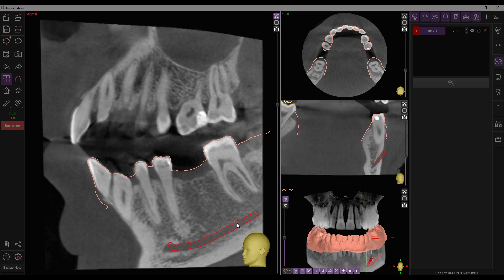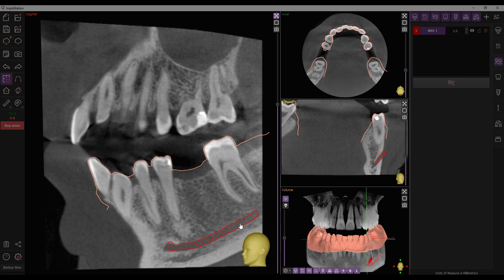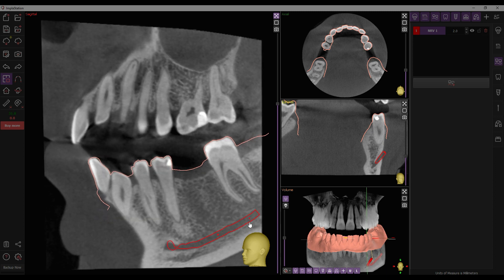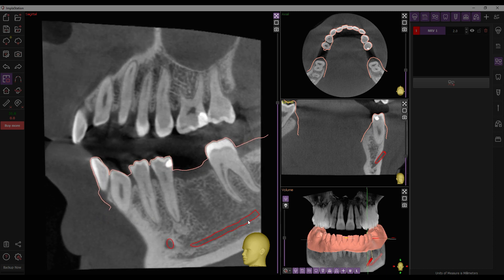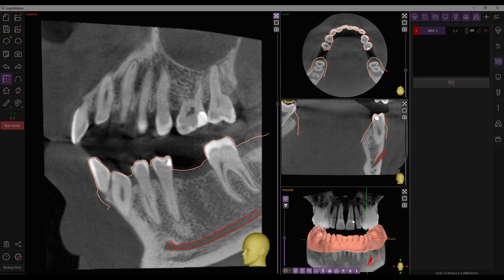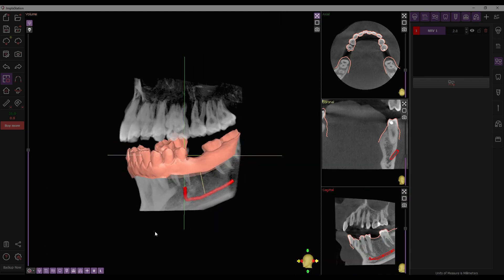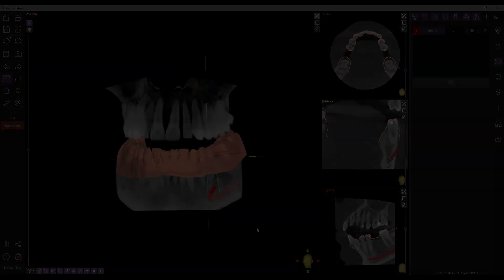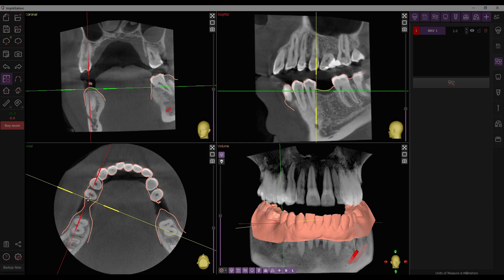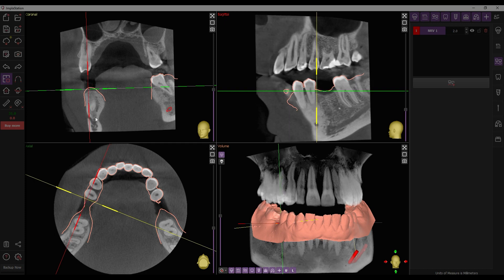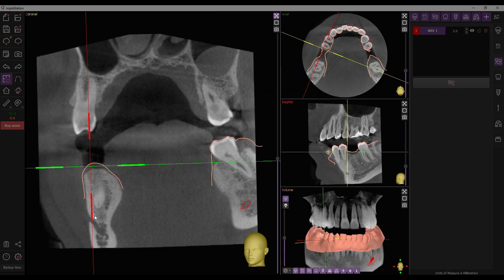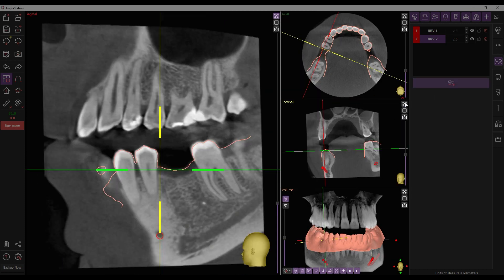Check the tracing in the sagittal window and adjust by clicking and dragging the marks. Optionally, you can also use the sagittal window to trace the mandibular canal.